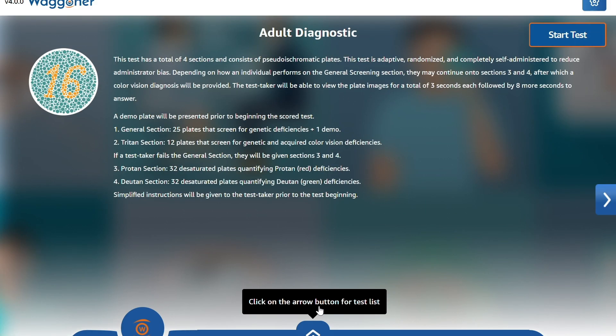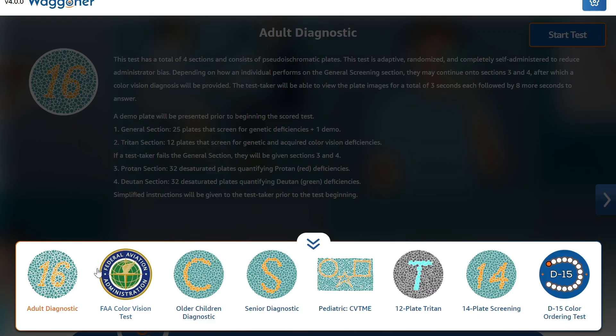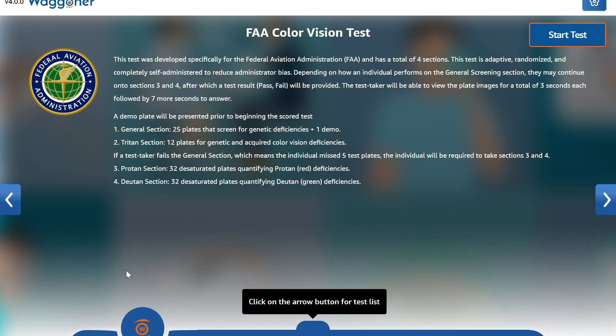Congratulations! You have installed and registered the Wagoner Color Vision Test Suite on your Windows device. You now have access to many Color Vision tests, including the FAA-approved Color Vision Test.